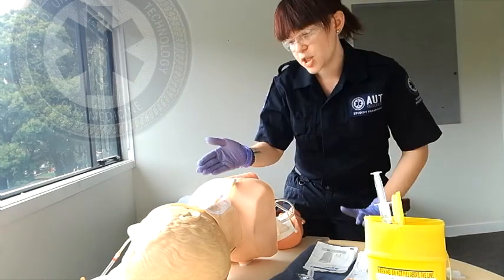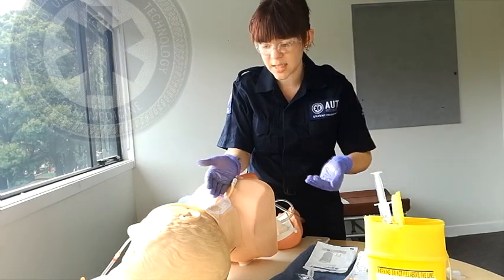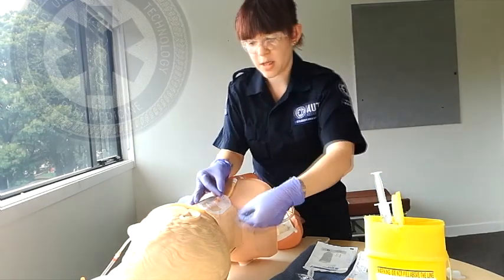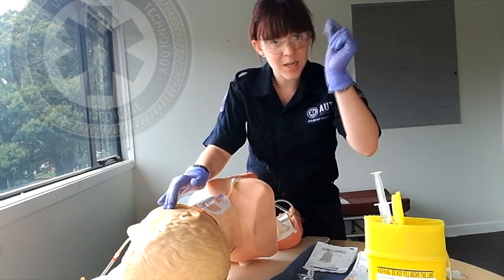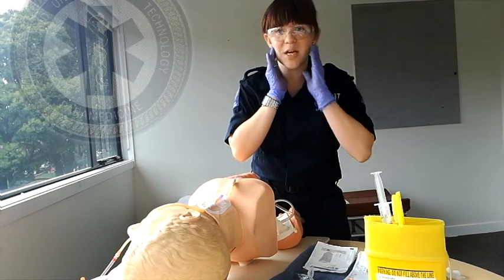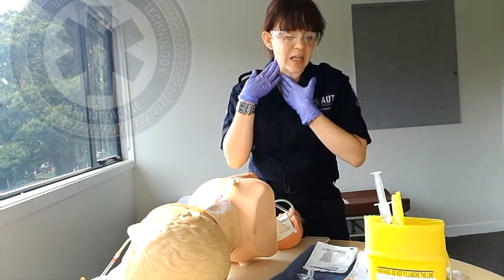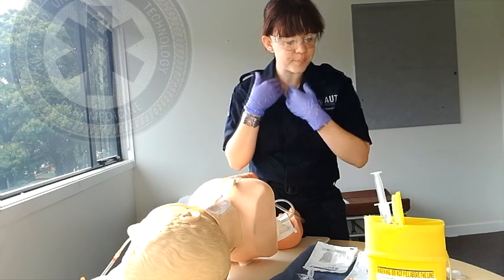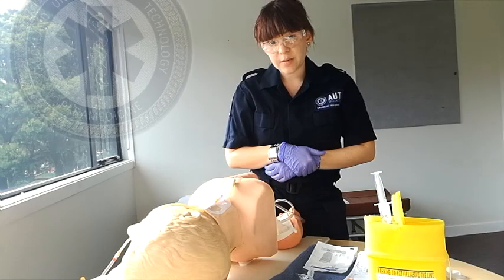When you attach a giving set and IV bag to this, you want to drape the line around the patient's ear and tape it to the patient's cheek. That helps ensure that if the patient moves their head suddenly, it doesn't pull on the line and cause any damage. So yeah, this has been my EJV cannulation OSCE — hope it was informative.